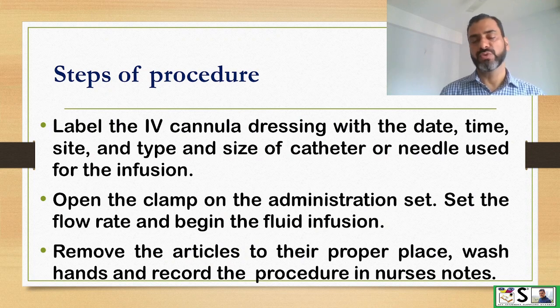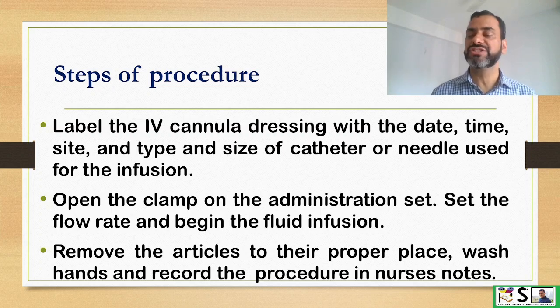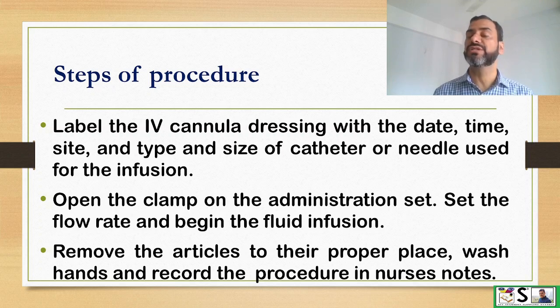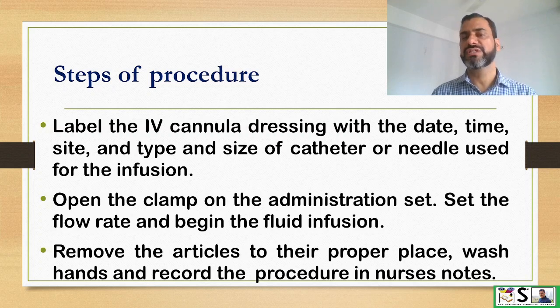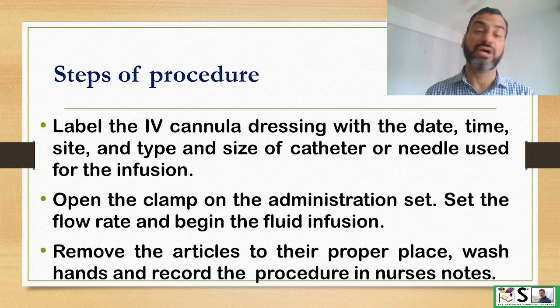Label the cannula with the date, time, and size of the catheter and needle used. Open the clamp on the IV drip set or administration set and set the flow rate as previously calculated. Remove the articles to their proper place and return frequently to check the site for infiltration or whether the cannula has come out.